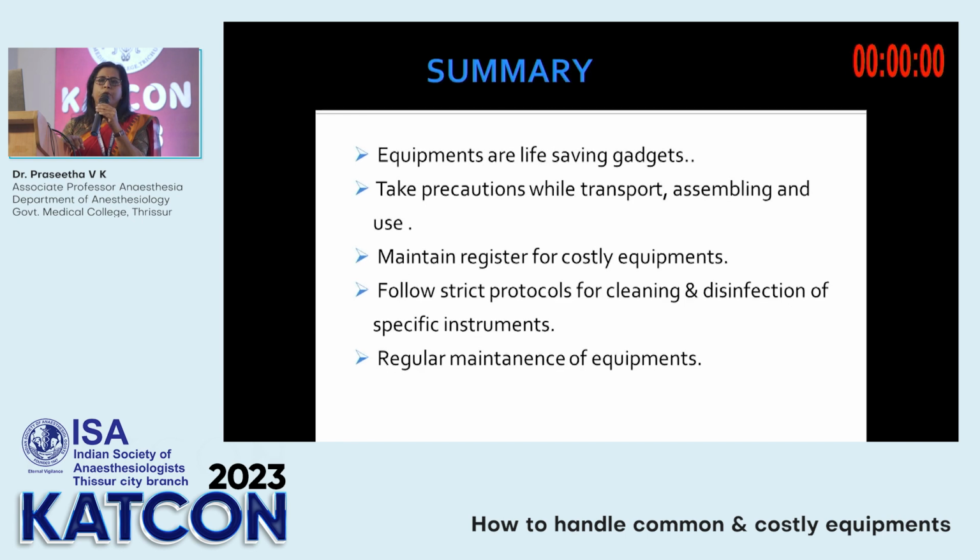Follow strict protocols for cleaning and disinfection. If you're not aware of how to clean, you learn it first, then you do it. Ask somebody, take a senior's help. Learn how to disassemble an equipment, how to clean it, and how to disinfect. And one thing that increases the life of an equipment is regular maintenance. If you are regularly maintaining an equipment, its lifespan will definitely increase.